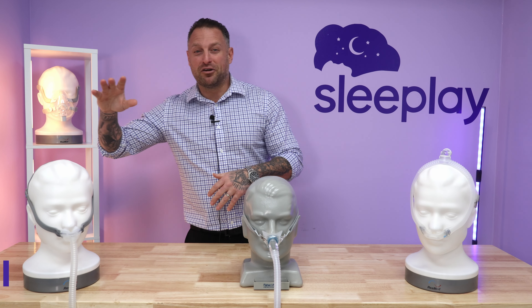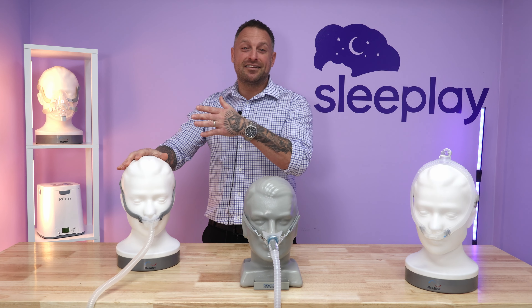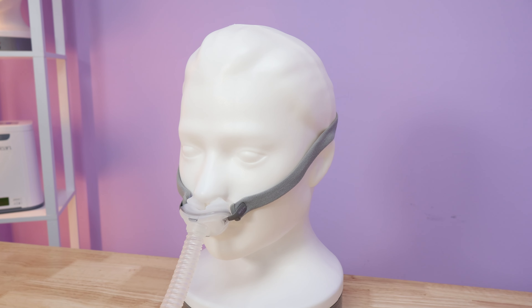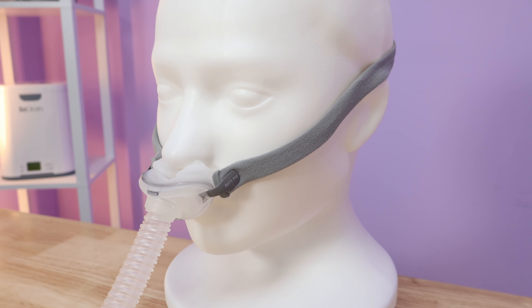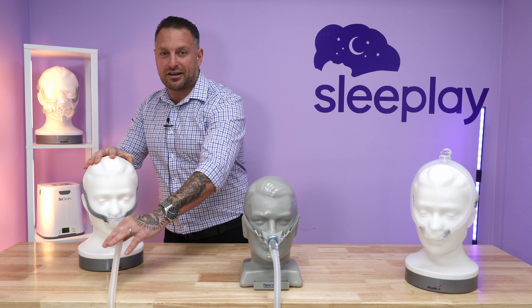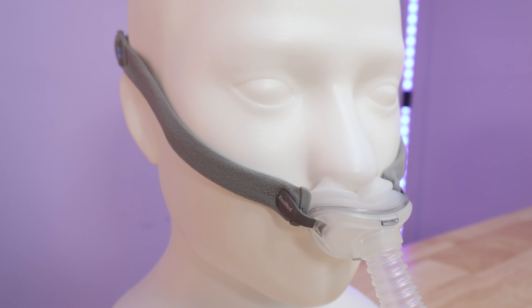First, we have the ResMed AirFit P10. Just when I didn't think they could make this mask any better, they did. If you enjoy the extra foot of tubing connected to your CPAP tube, it does come with that. It's on here for good — it's not going to come off in the middle of the night. This is a very minimal headgear as well.